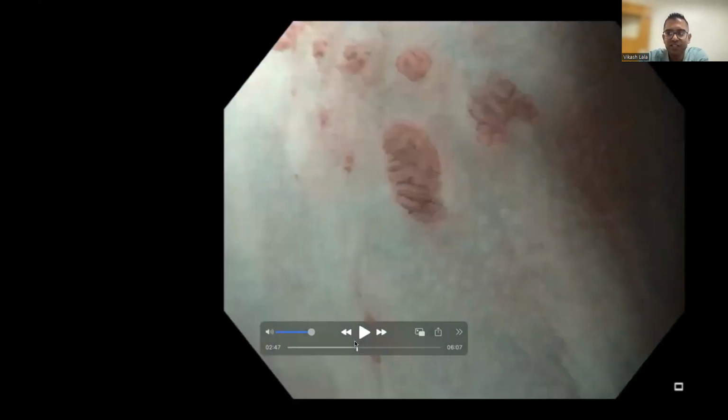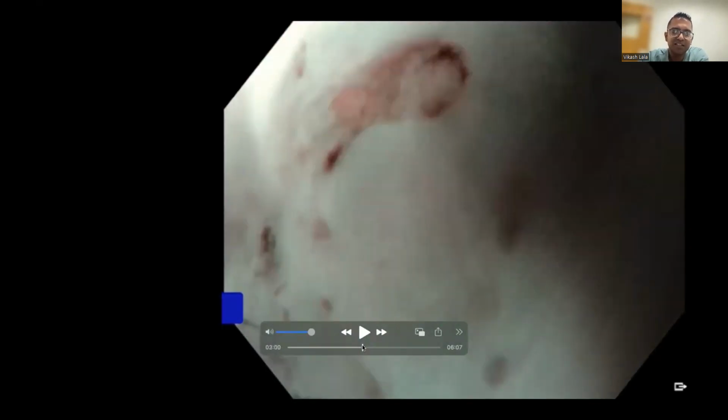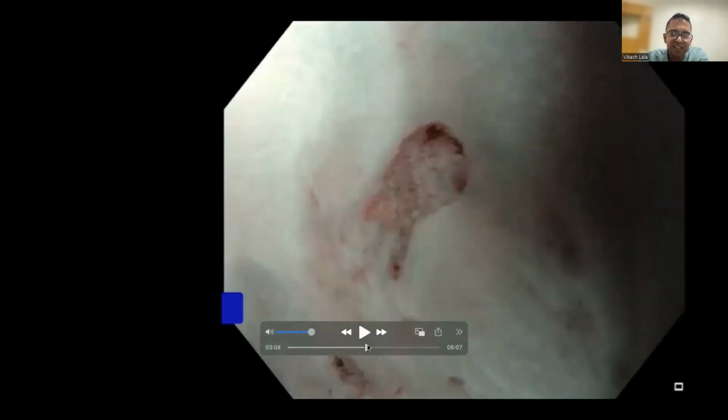So this is not where the nodule is. But in these islands, you see a beautifully regular mucosal and vascular pattern. So these little islands I wasn't too worried about as being dysplastic or malignant. But we can't see what's under the rest of the squamous. So there could certainly be other foci of high-grade dysplasia or of cancer. And that's where the issue comes in.